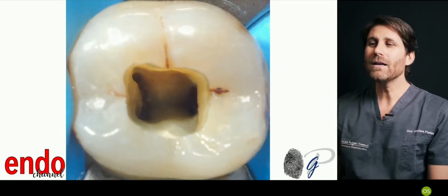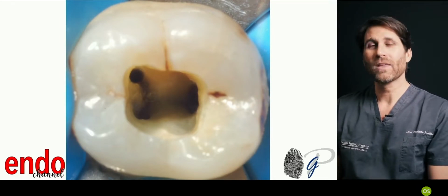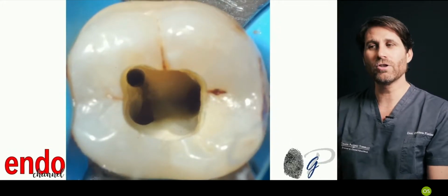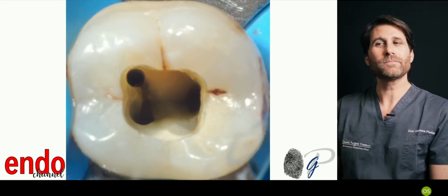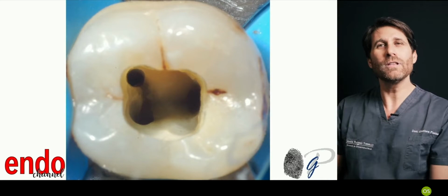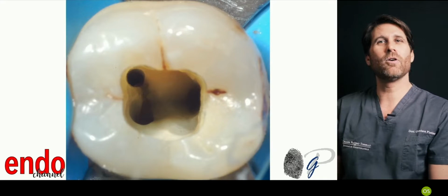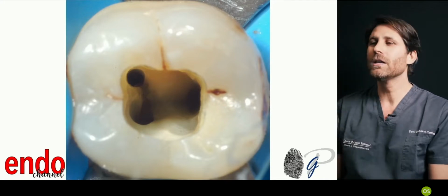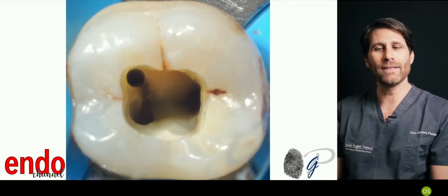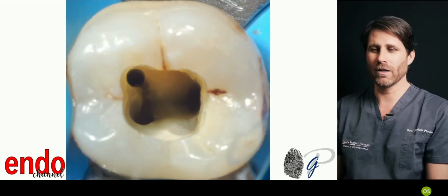enlarging dynamically with the instruments only what the instrument needs to reach the working length in a safe and predictable way. So if the instrument has some difficulties to reach the working length, we just stop and remove a little bit more of the coronal interference, usually with the same file. No need to use Largo, Gates burrs, or diamond burrs, or carbide multiblade burrs to remove this interference. Today we have in our hands the possibility to do it together with the root canal instrumentation phase, and we will see this concept along all our journey in the endochannel.